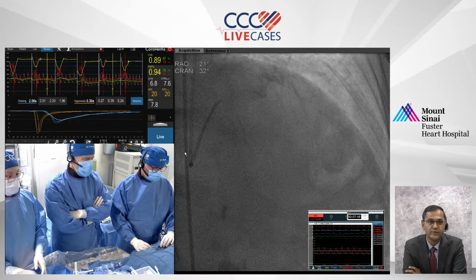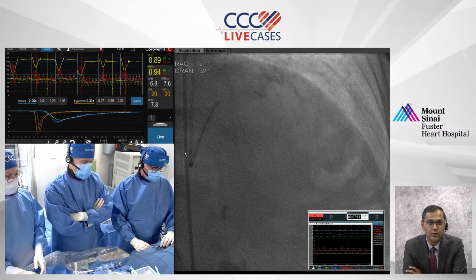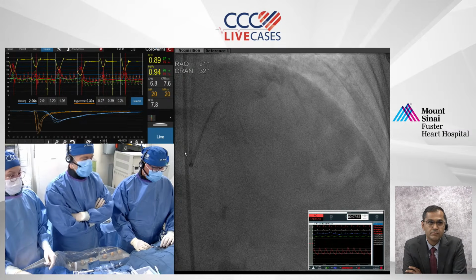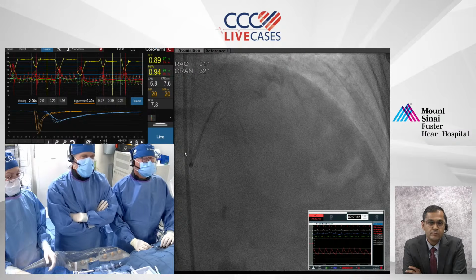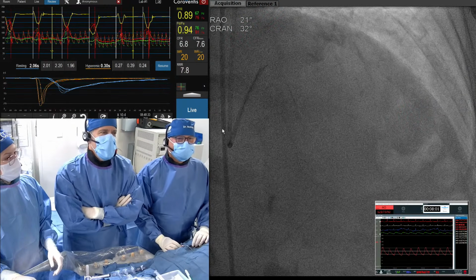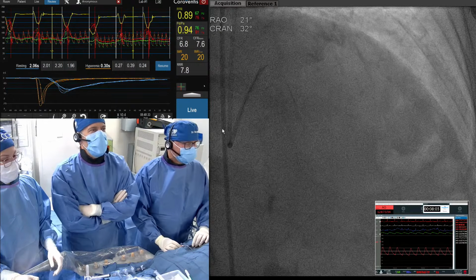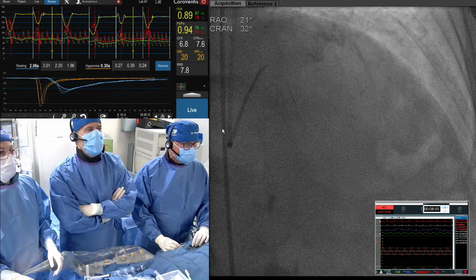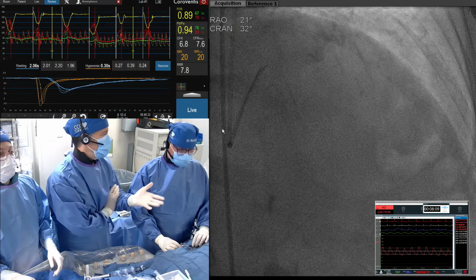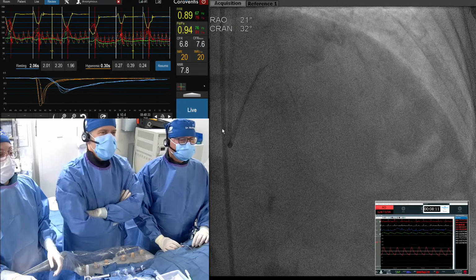My question for you is, what's next for this patient? She's had quite a bit of a workup so far. Good question. Next for me is to do it in the circumflex. Well, I think we will do that, but I think the important thing here, I would interpret this stress test as she was a left dominant system. We see that all the time in these diminutive rights.